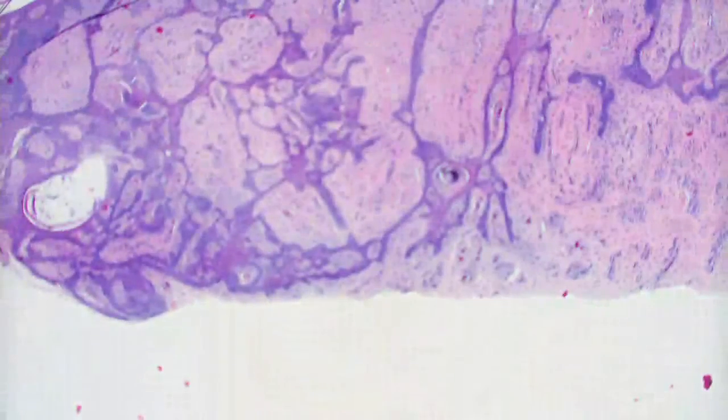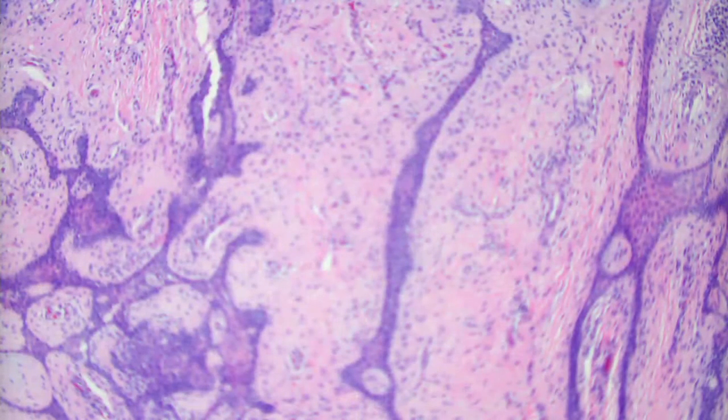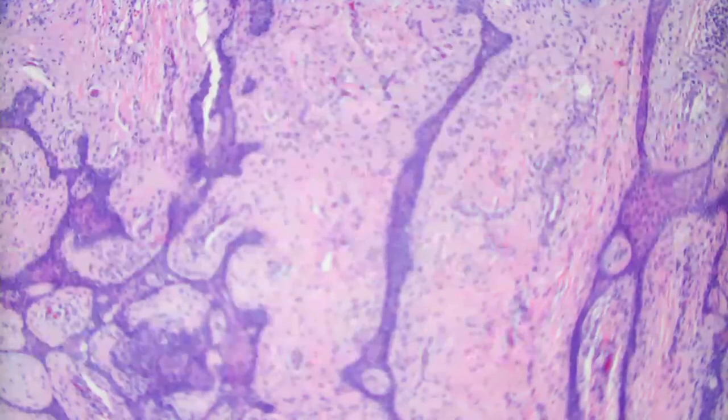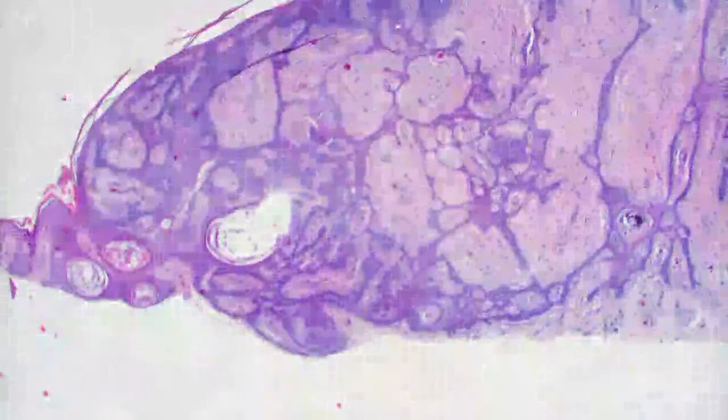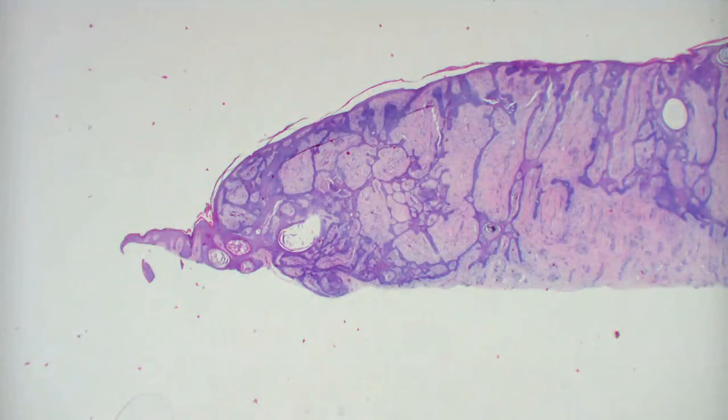Notice the stroma. It's very fibrotic. And so if you get one of these, you really don't want to D and C it because the stroma is so thick you're not going to be able to curette it away. You have to actually excise these. They tend to behave in a very indolent fashion. Although they're classified as a form of basal cell, they don't really behave like a classic basal cell carcinoma. They usually just kind of sit back in somebody's lower back like here, and they don't really change that much. Occasionally you'll get one that might sort of crust over, and it looks like a little focus of nodular basal cell carcinoma arising in it.